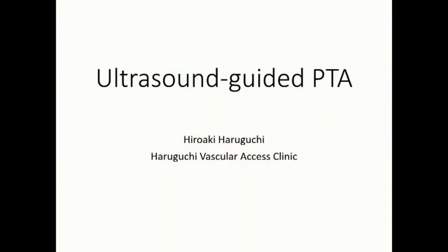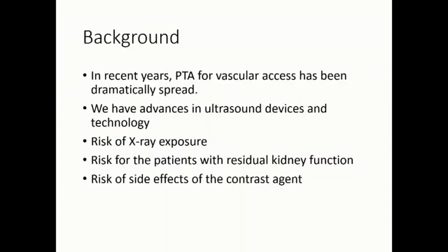Ultrasound-guided PTA. I'm Hiroaki Haruguchi from Haruguchi Vascular Access Clinic. The background: in recent years, PTA for vascular access has dramatically spread. We have advanced in ultrasound devices and technology. Risk of X-ray exposure. Risk for patients with residual kidney function. Risk of side effects of the contrast agent.